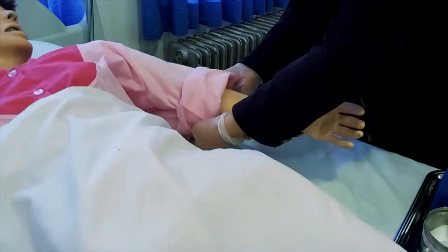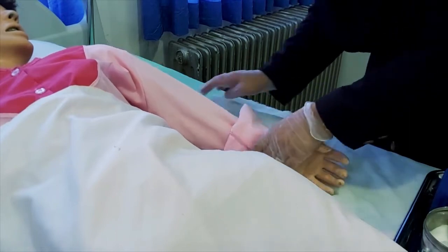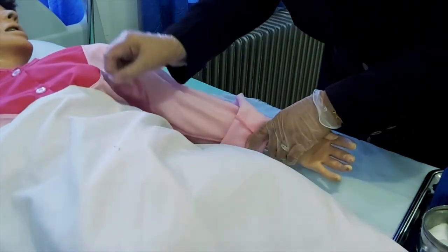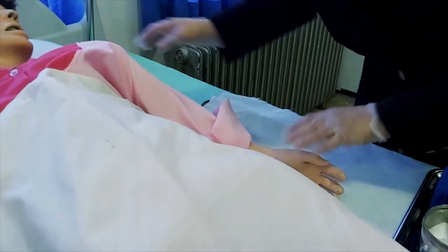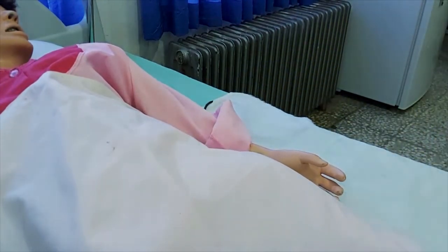لباس و ملحفه بیمار را مرتب می‌کنیم. در نهایت فشار به‌دست‌آمده را در برگ علایم حیاتی و پرونده بیمار ثبت می‌کنیم.